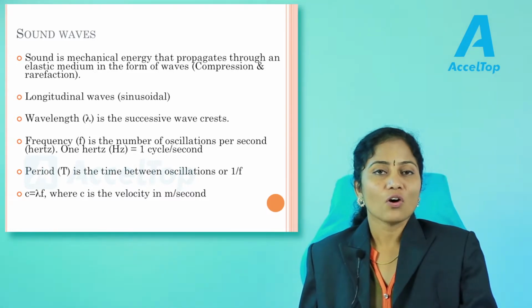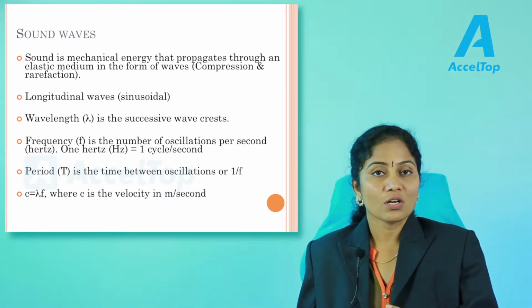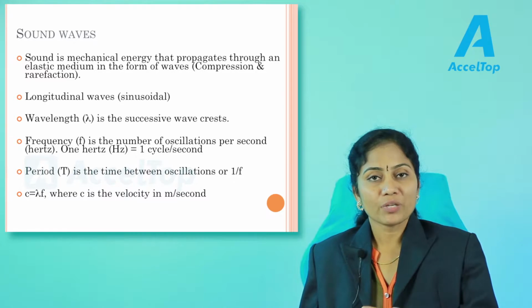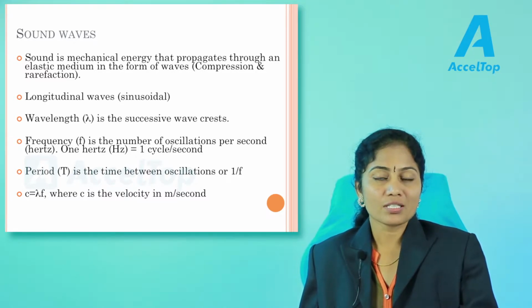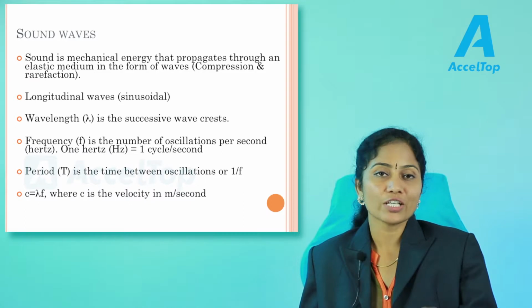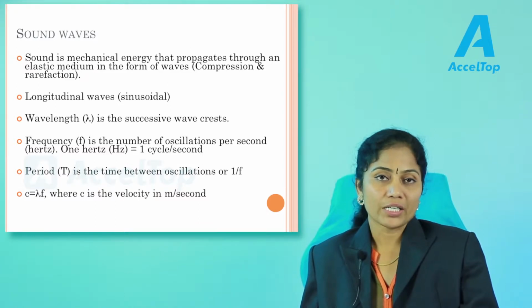Non-ionizing radiations are very helpful because ionizing radiations are very sensitive for rapidly dividing cells. In the pediatric age group and in pregnant patients, we have rapidly dividing cells, so they will be very sensitive to ionizing radiations, and that can lead to lethal damage. So the best is non-ionizing radiation, and hence ultrasound plays a vital role in diagnosing normal and abnormal things during pregnancy and in the pediatric age group.